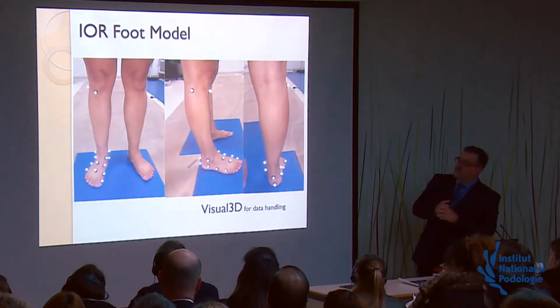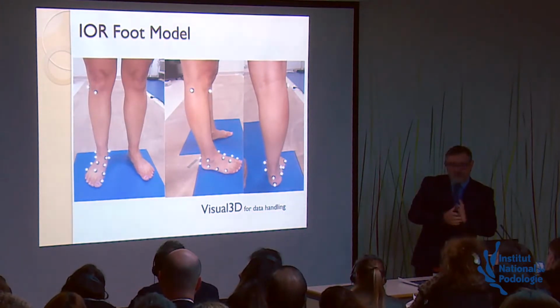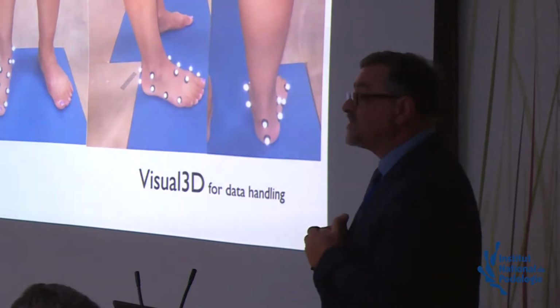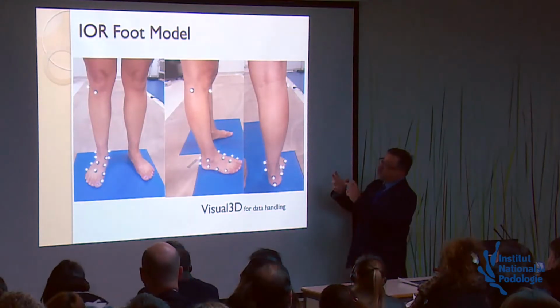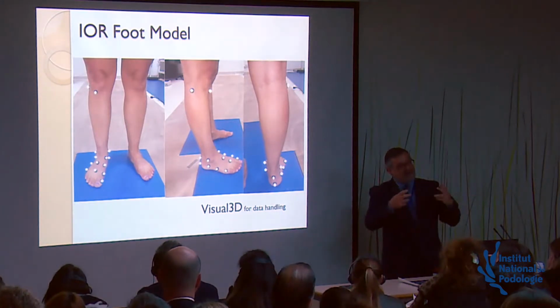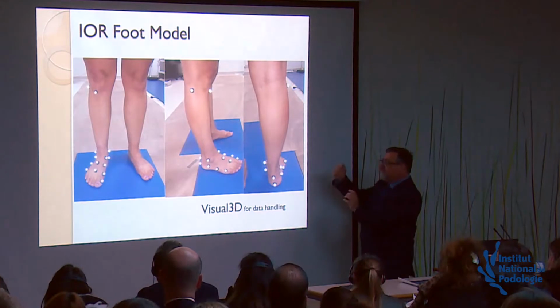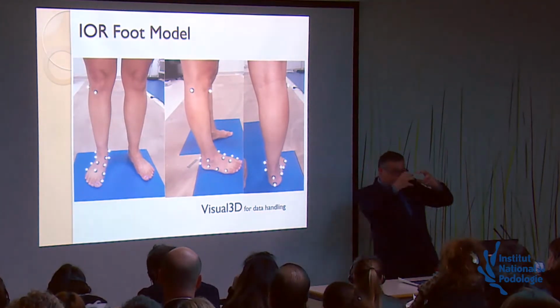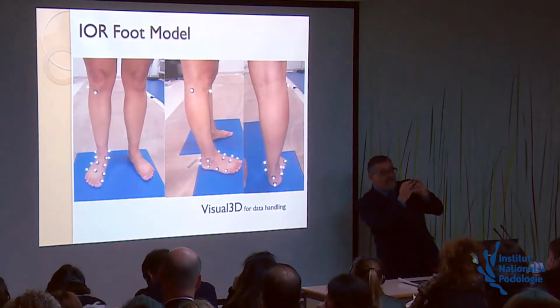We used what is known as the Istituto Ortopedico Rizzoli foot model, also known as the Leardini foot model. It's very widely used because the Leardini foot model allows us to measure intersegmental motion of the foot. It divides the foot into a hind foot, midfoot, forefoot, hallux, and shank region. So we can measure the intricate motions of the different segments of the foot.